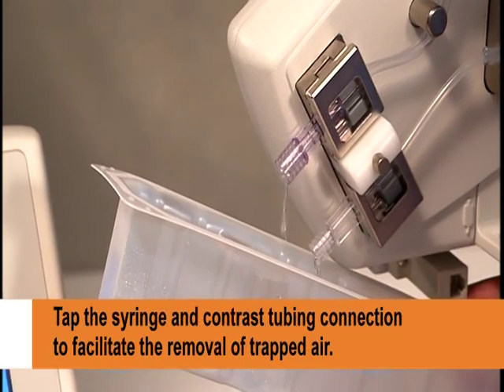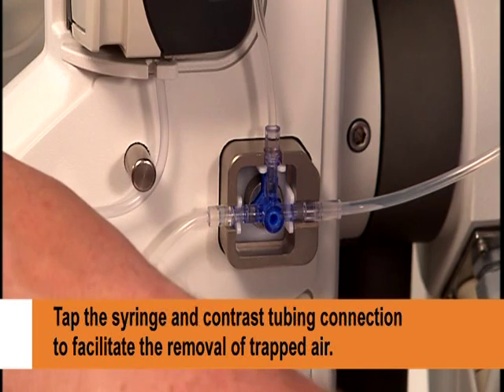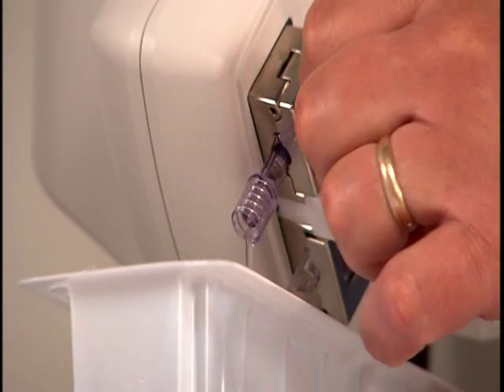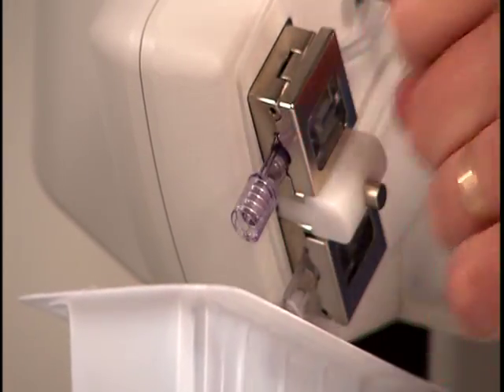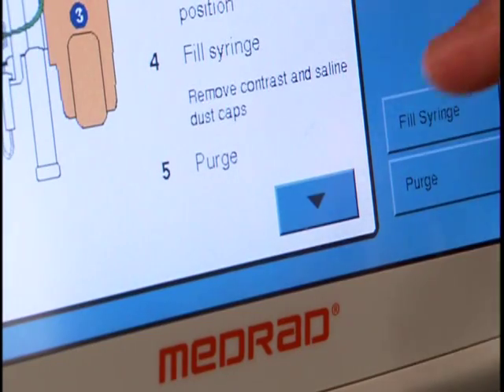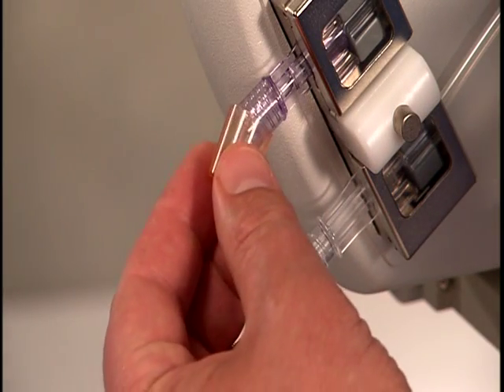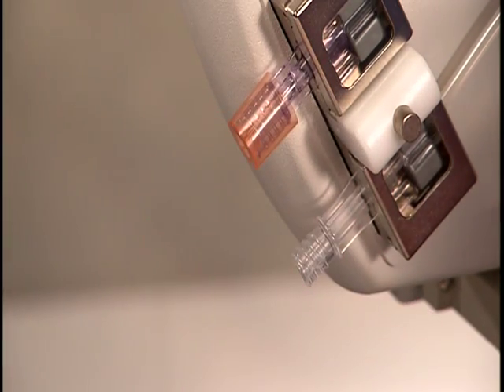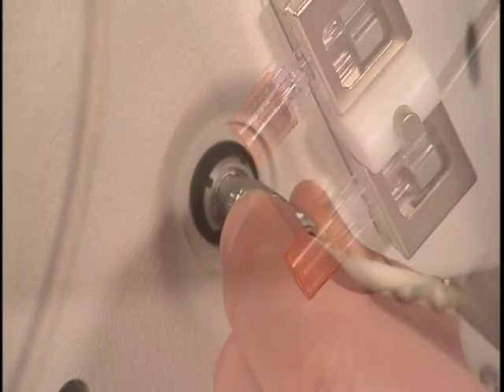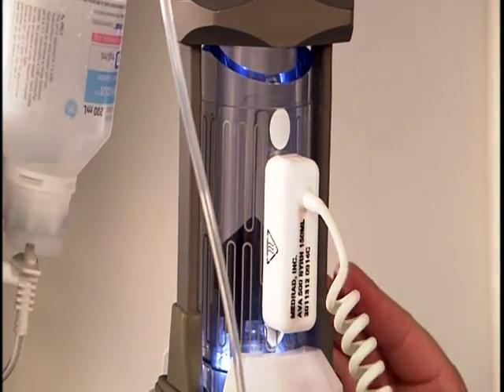Catch the purged fluid in a container while tapping the syringe and tubing connection to help release trapped air. Touch Stop when all visible air has been removed. If necessary, repeat these steps until all air is purged, then touch Complete to exit the screen. Touch the down arrow. Finally, either replace the saved sterile dust caps on the contrast and saline multi-guard connectors, or use caps from a new package. If you are using syringe and bottle heat maintainers, attach them to the syringe and contrast bottle.